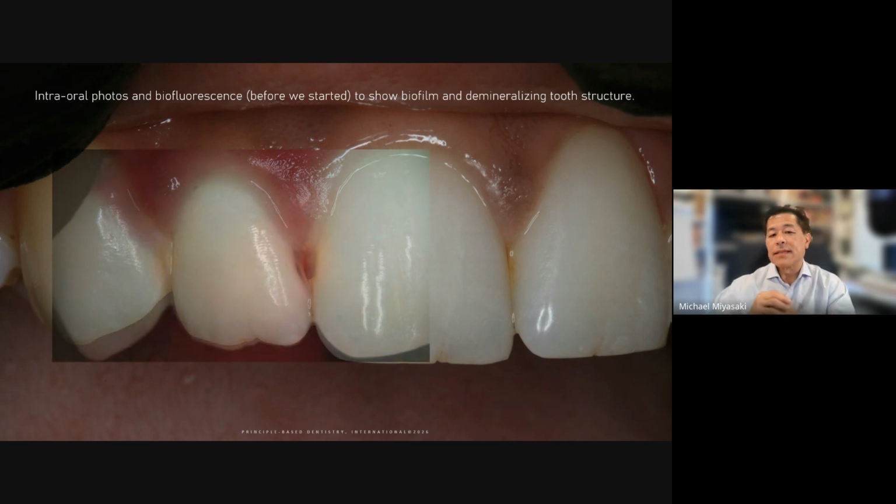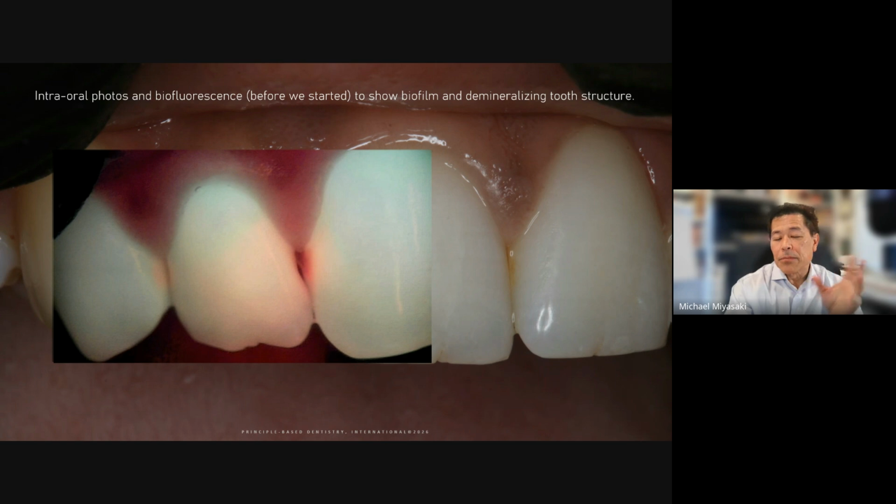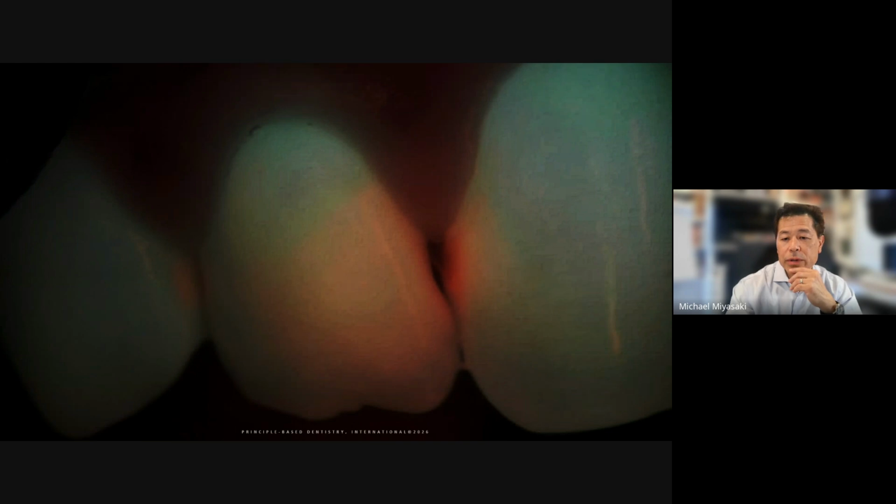So now when we light this up and I'm shining the light at this area, you can start to see the red glow that's showing up almost throughout that lateral. And now as I bring that picture up, you can see that that lateral incisor almost glows red. So the more incisal two thirds is red, and the distal part of that right central also is red.